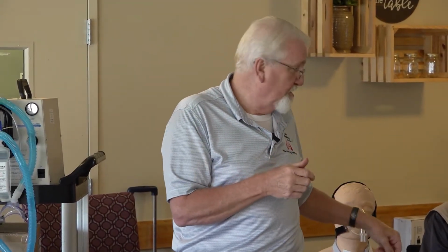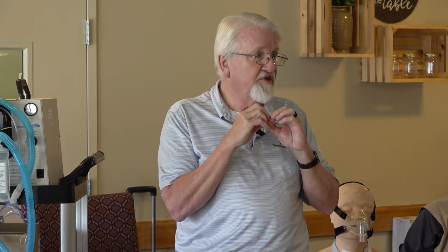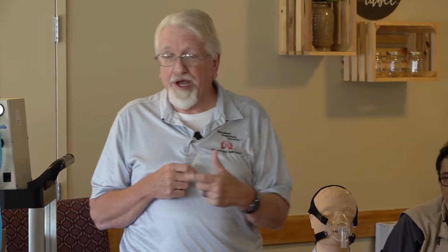You're going to clean in, back and forth a little bit, twist 4 or 5 times, out. Same process with the plunger, and it's still water on your side. You're going to let the doctor, nurse practitioner, whatever know that his TEP is not patent. You guys aren't going to pull it out.